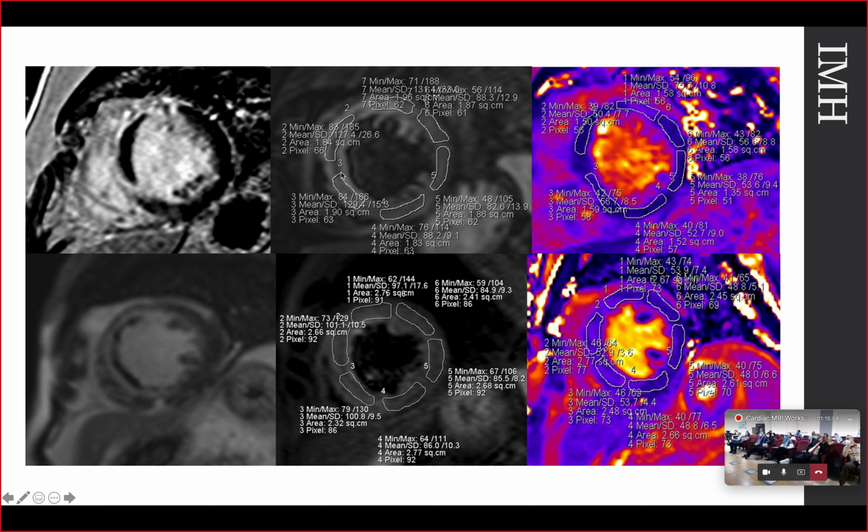I'm not sure, could you see a thin line of hypointensity in the STIR in the middle of the edema area, or the area at risk? This explains why the T2 maps are coming out at 50 and 52, although visually we could see edema areas.